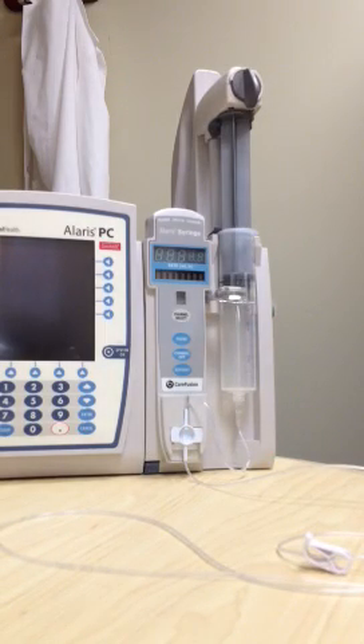You are now ready to turn on and use your syringe pump.